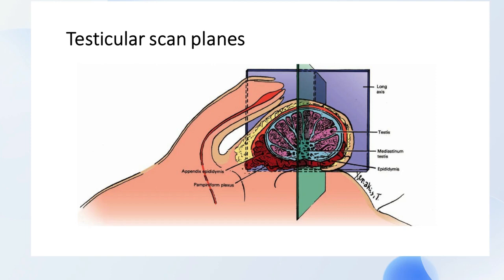However, sonographic anatomy is a little bit different from the basic anatomy and histology that you do when you're doing your medical degrees. Because certain things that are learned in histology, in embryology, in basic anatomy, are not visualized in our daily practice in ultrasound. So you have to limit yourself to anatomy that you can visualize. That's the anatomy that I'm going to capture here, and then we'll build it from there.